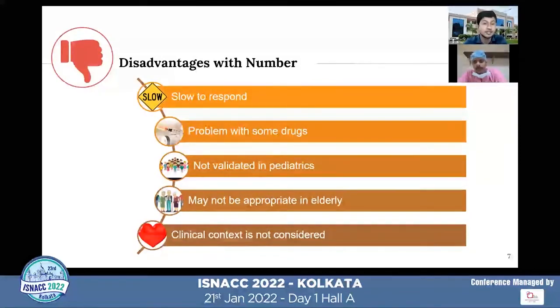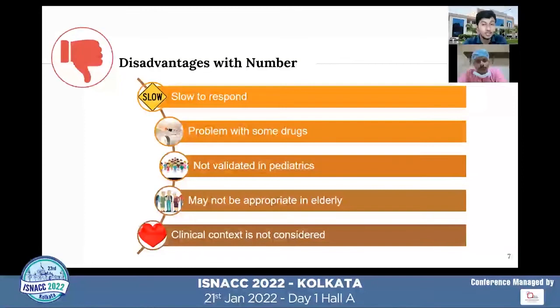Basically, as already mentioned, we have an inherent delay because multiple steps are involved, and the index number that we see is not an instantaneous value. It is usually an average value over seconds or minutes. Next, these monitors have some problems with certain drugs. For example, with dexmedetomidine, there will be an increase in frequency towards the slower waves. This might give false low values, even though the patient might be easily arousable. Similar is the situation with ketamine also. It can cause false high values, even though the patient may be sedated.